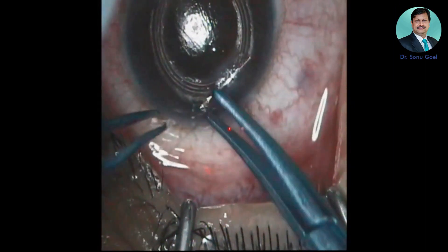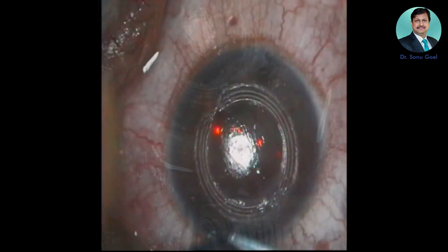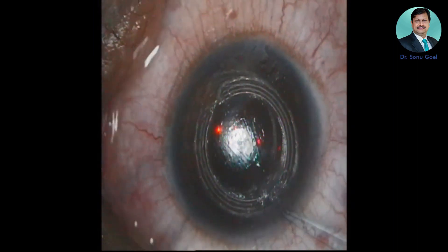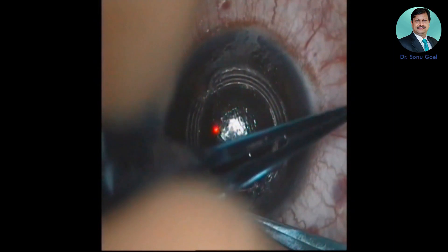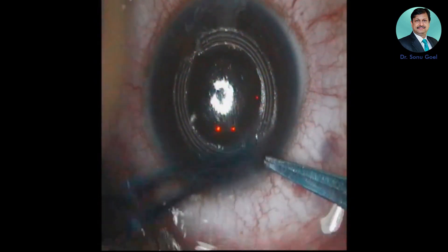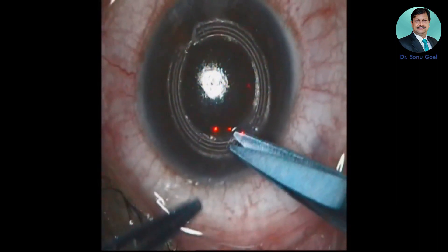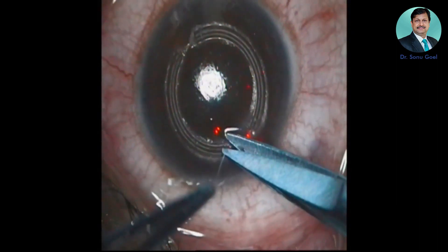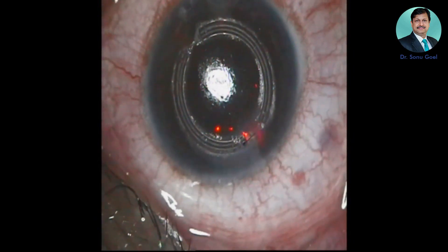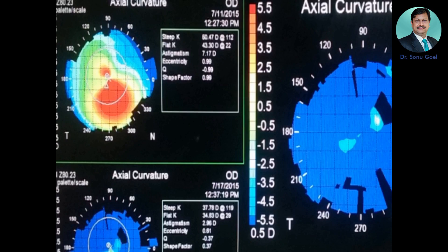I usually apply a nylon suture on the entry point to equally distribute the vectorial forces. This suture can be removed after three to seven days. We usually apply a bandage contact lens on top. A drop of antibiotic is then placed and the patient can be sent home. These are the difference maps at day one and one month.